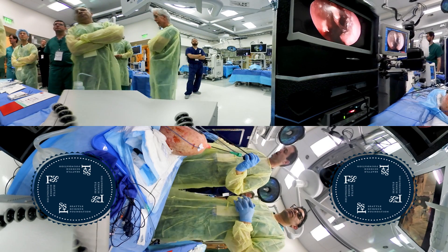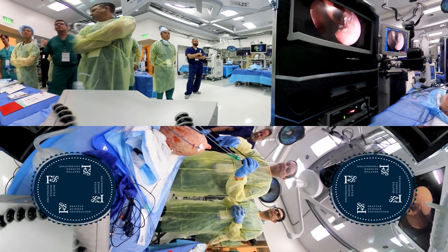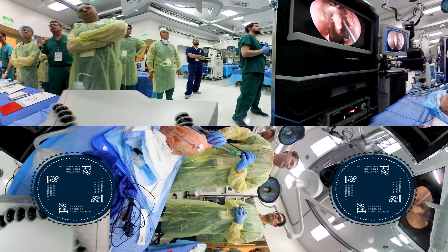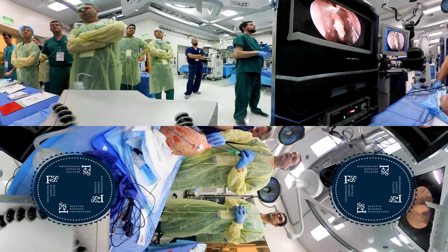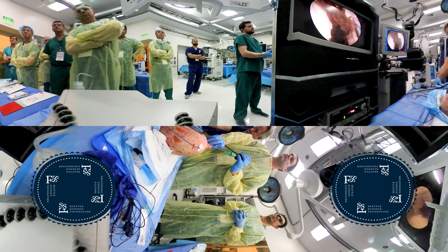This is a very quick orbit decompression. The key thing with orbit decompression is to do thorough sinus surgery, because you never want to have to go back and do sinus surgery on someone you've done an orbit decompression on. That's not fun — the fat herniates into the sinus cavities and it's tough.